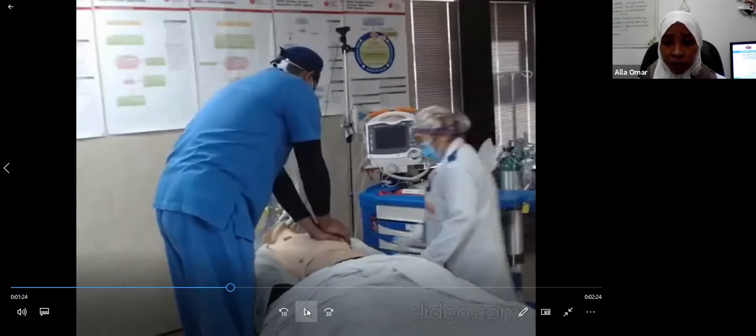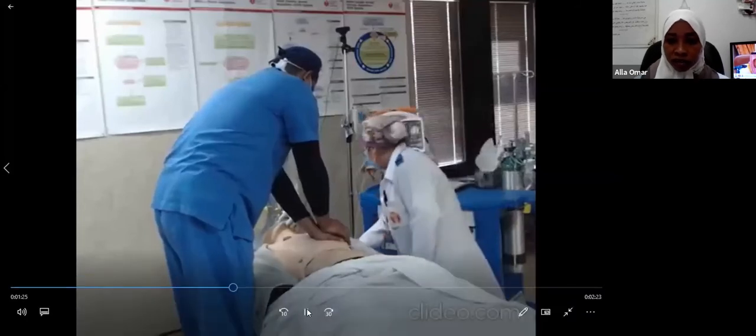In case this happens, let's say it is not in the unit and we don't have wall-mounted oxygen or suction, it is complete, even in the main entrance, in the OPD, and these places where you will not have oxygen sources in the wall. So our crash cart is really complete. Then we'll see what she did next.